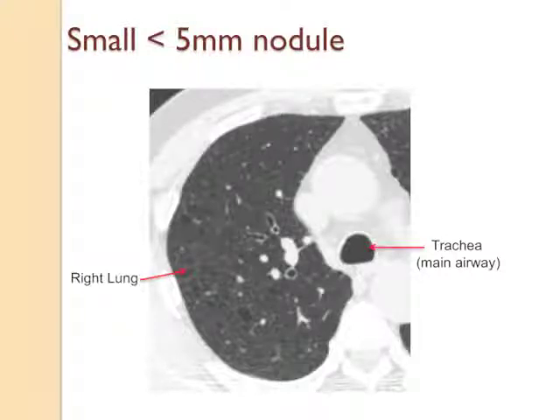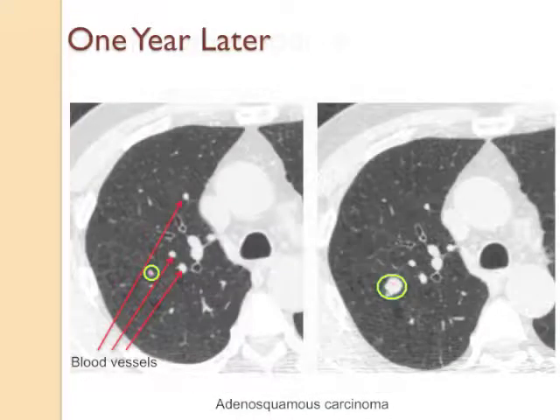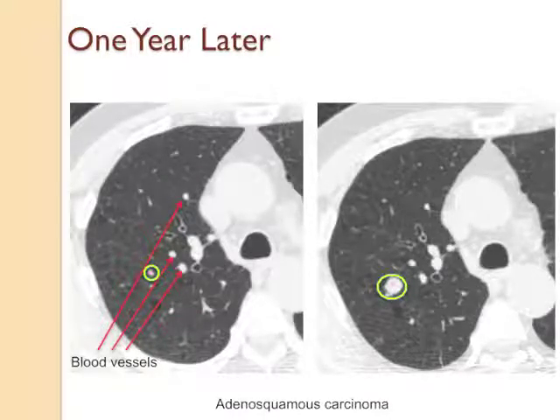Well, here's a picture. This is a CAT scan. This is the right lung. This is the major airway here. And very hard to see anything, but here is a little tiny nodule. I have a little X on it. And this is what happened. Nobody did anything. Nobody noticed this little small nodule at that time. Looks very much like these other small dots, which are actually just normal blood vessels. And nobody noticed this. But look what happened in a year's time.